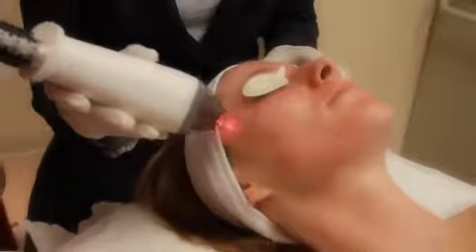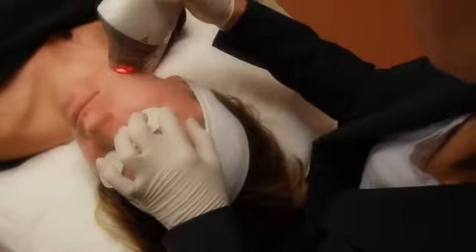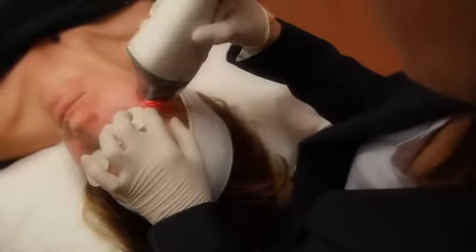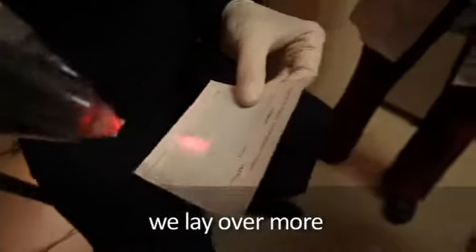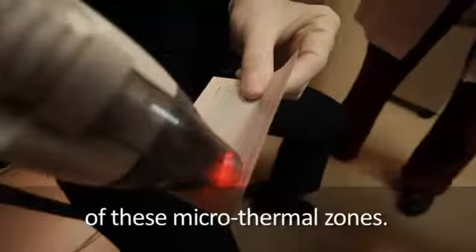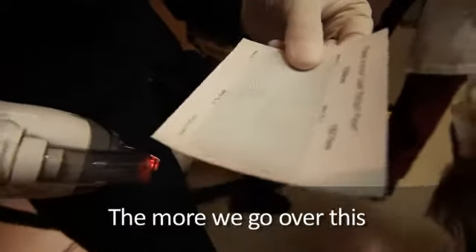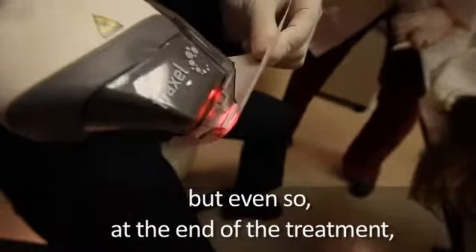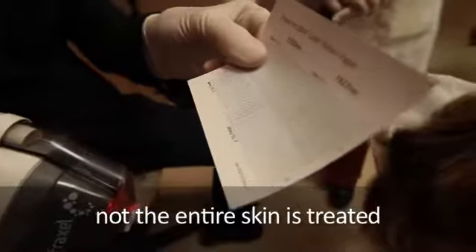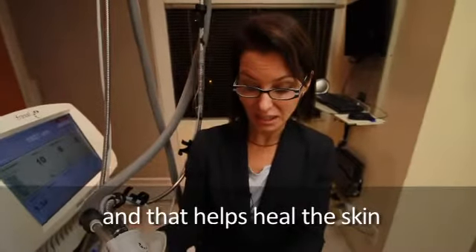When I do the thulium laser, I take my handpiece and roll it over the skin a certain number of times to get enough energy into the skin. It goes into the epidermis — the top layers of the skin — and sometimes into the very superficial layers of the dermis. Each pass lays down more micro thermal zones, little packets of heat. The more we go over the area, the more skin is affected, but even at the end of treatment, not the entire skin is treated — the untreated areas help the treated areas heal faster.